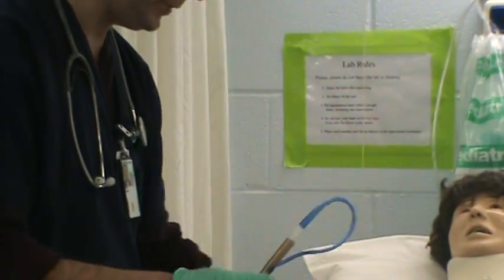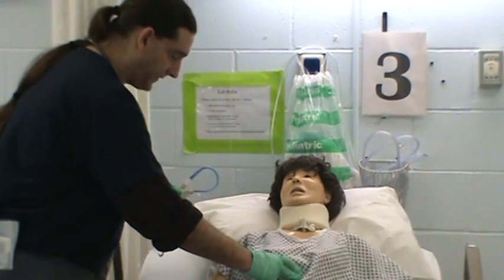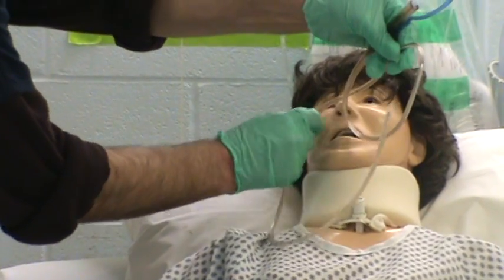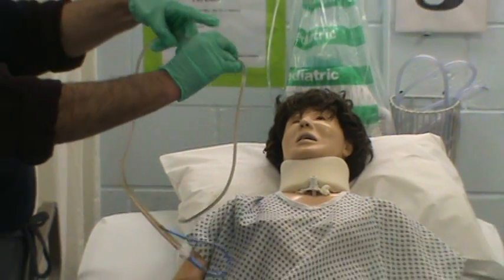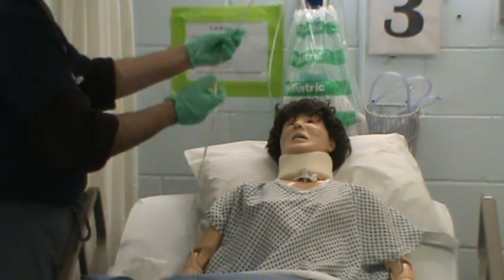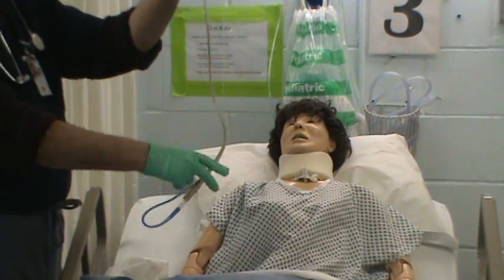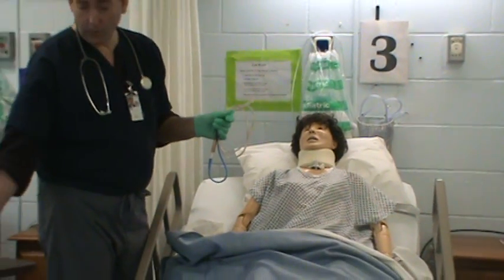Now we're going to check the landmarks to find out how far down we're going to put this tube. Find the xiphoid process, put the tube at the xiphoid process, up to the earlobe, then to the nose. You can mark it with a piece of tape or count to the third hash mark — make sure you're counting from the end. Or you can go the other direction: end of the tube at the nose, to the ear, down to the xiphoid process, stopping at the third hash mark. Either way, it's the same thing done in the opposite direction.